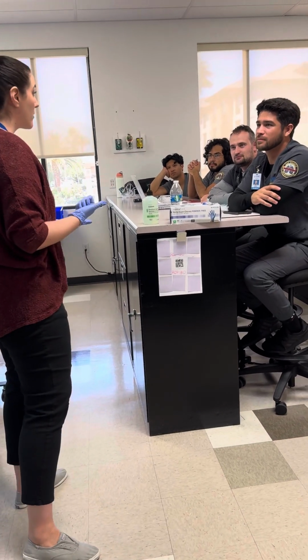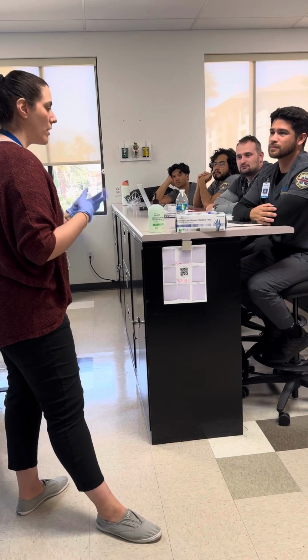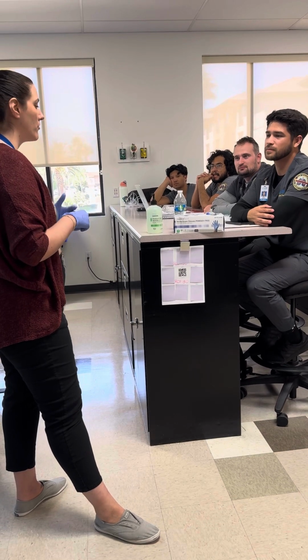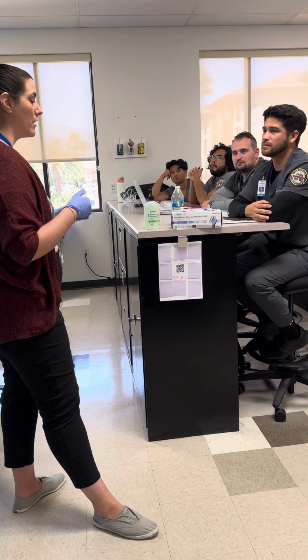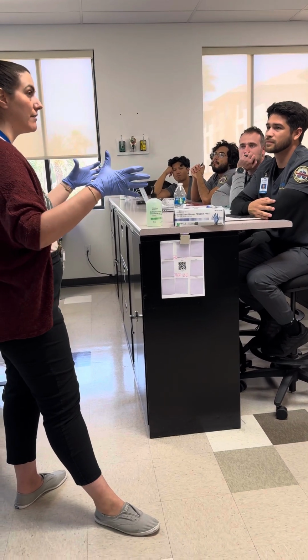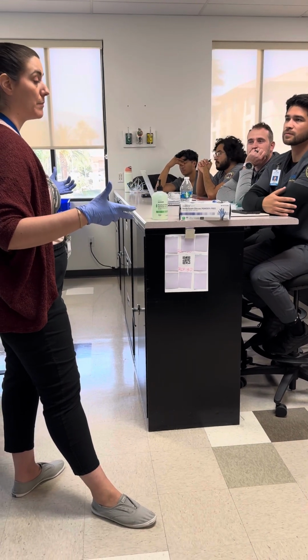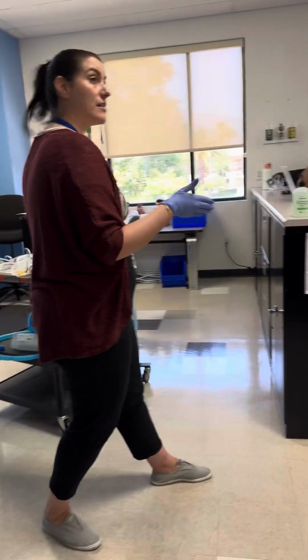I see the doctor has ordered me at bedside to give you some oxygen therapy. We're going to go through that in just a moment, but it shouldn't take more than maybe 10, 15 minutes at the most for me to do all these interventions with you. And I'll tell you what I'm going to give you in just a moment. I'm saving a space to give the explanation part of the AIDET once it's actually time to implement the therapy.